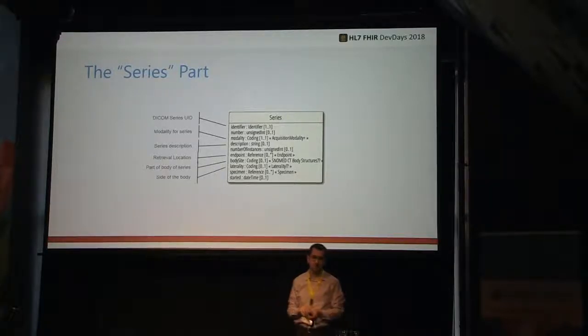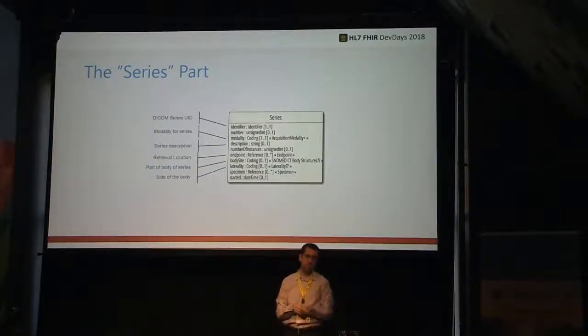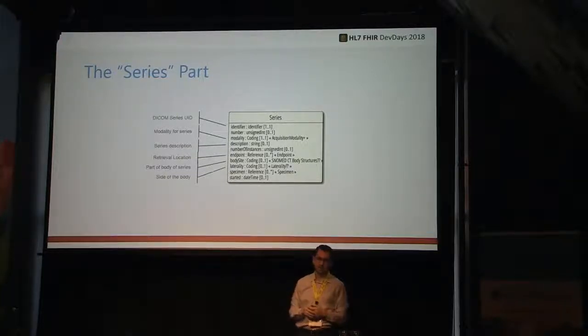It could be anything. But again, at the end of the day, once you've gotten to the study part, the reality is the rest of it is really owned by DICOM. As I said, it's the ultimate source of truth, so I probably would go to it, even if I can find the information in FHIR. Unless you have a really good reason not to, like the DICOM service is super slow, or it's behind a firewall, you can't reach it, etc. You know what I mean? It's just a specialty thing. Okay, any other questions? Oh, go ahead.